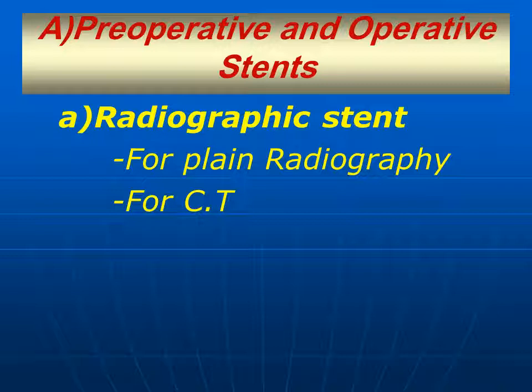To start with the preoperative and operative stents, we have the radiographic stent, which is one of two types. One is used for plain radiography, and the other one is used for cone beam CT or conventional CT.